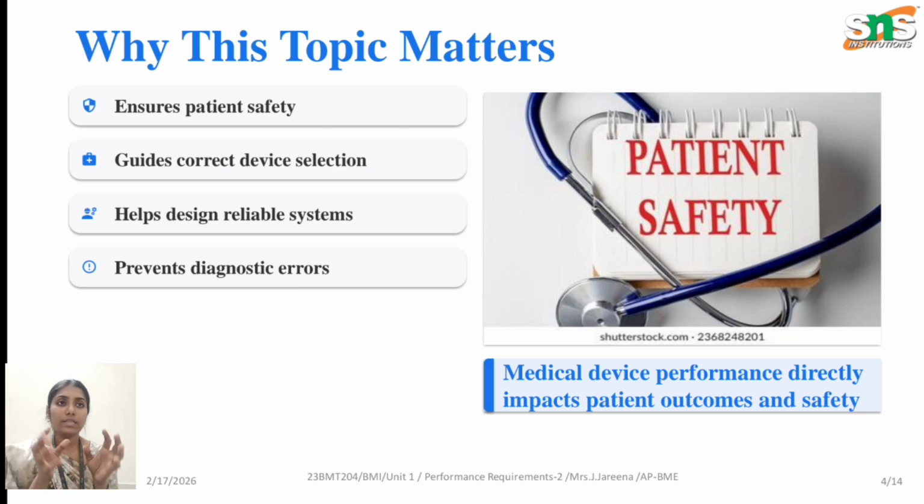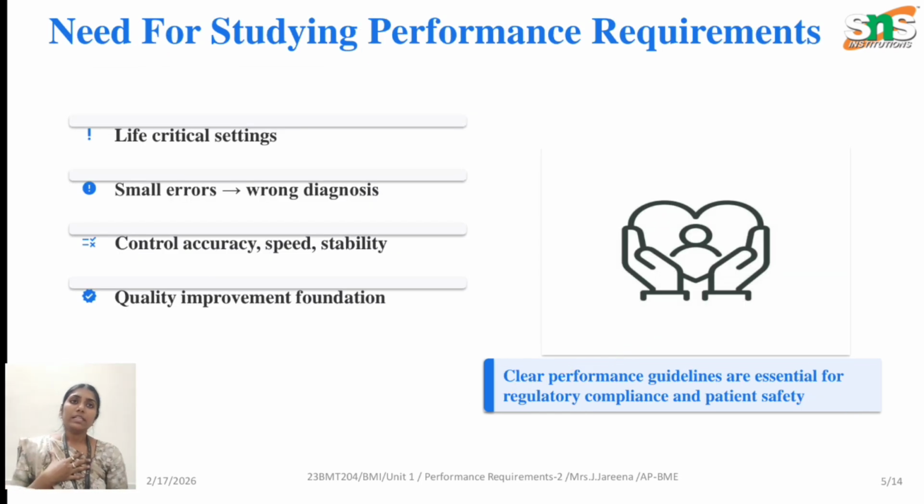So performance requirements must be considered and incorporated in designing the medical device, and we must check whether they are met before we use the device on the patient.